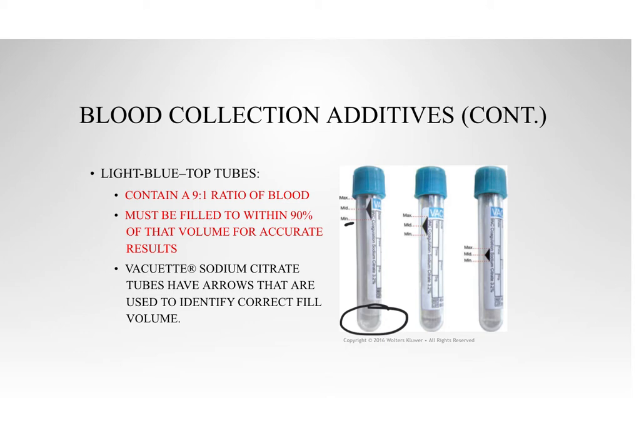And then there are 2 different sizes that allow less to be drawn. So make sure you get the right size for your patient. If you have an elderly patient, a hard stick, or a little kid, all kinds of special circumstances, you might want to get that tube that needs less blood, so that you're not having to worry about filling it all the way up.